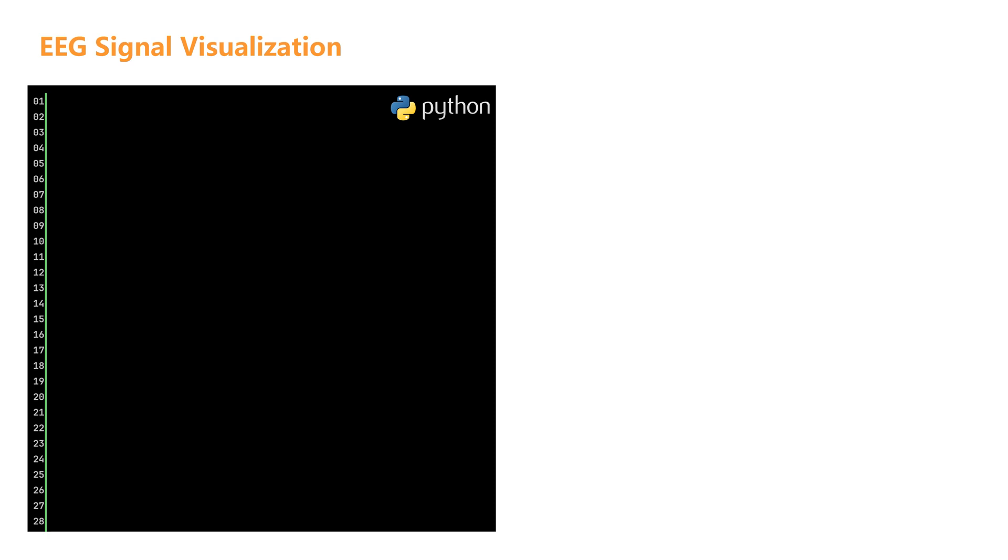In Python, there are two main methods for visualizing EEG signals: using the built-in visualization tools of the MNE library, or creating custom plots with matplotlib. First, let's learn how to use the built-in methods of the MNE library for quick visualization.